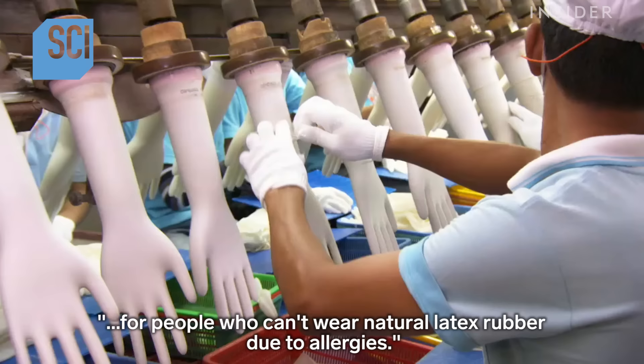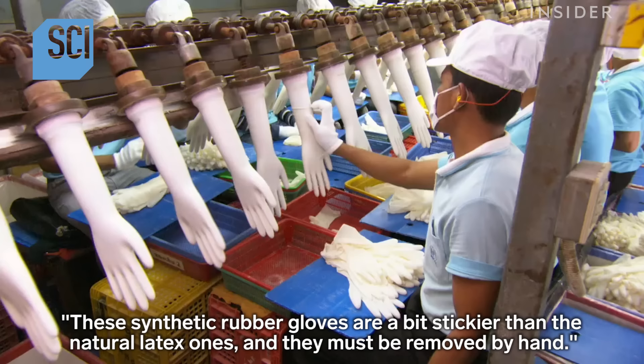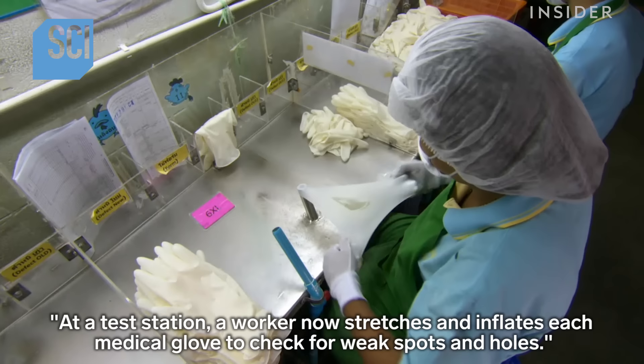These particular medical gloves were molded from synthetic rubber for people who can't wear natural latex rubber due to allergies. These synthetic rubber gloves are a bit stickier than the natural latex ones and must be removed by hand. However, the natural latex gloves come off much more easily — bursts of pressurized air blow these gloves off the ceramic forms.